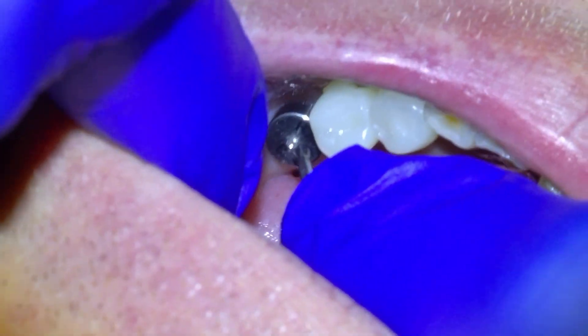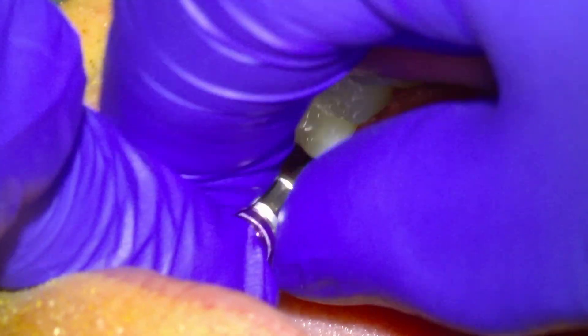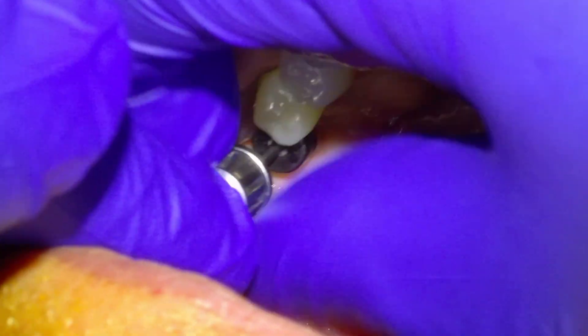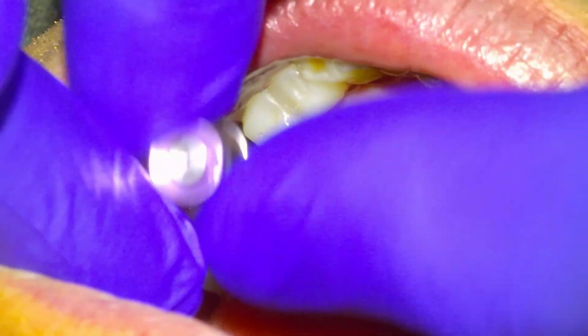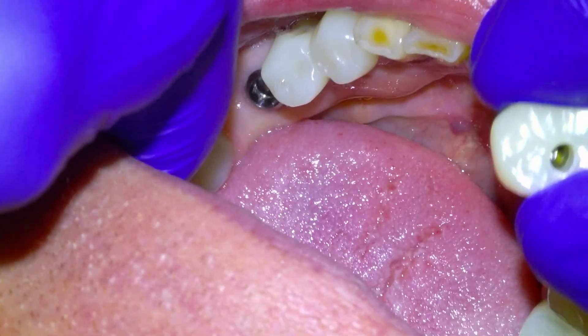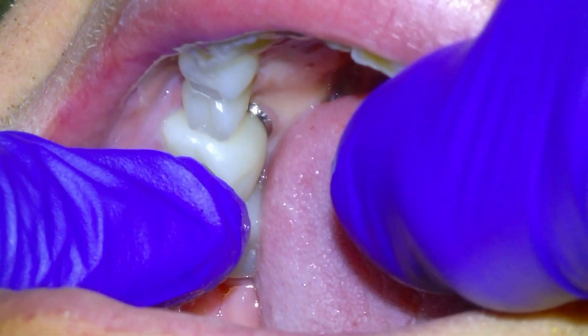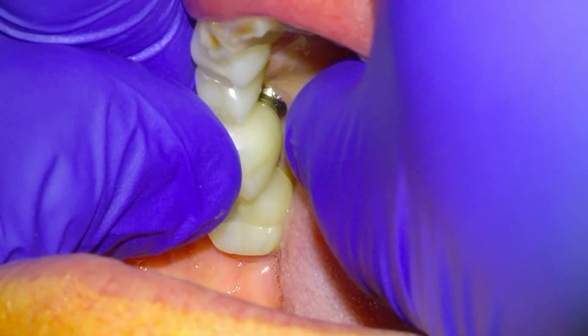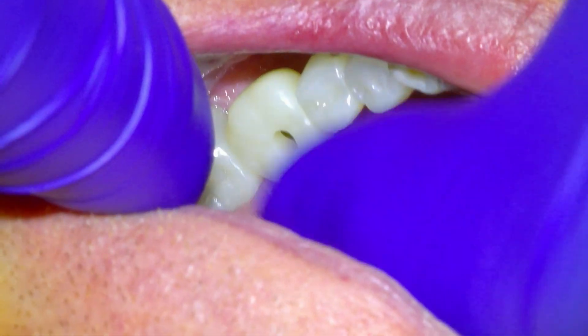We'll take the healing cap off first here. Sometimes it can take a little bit of elbow grease to get it down the first couple of times. When we check the tightness, so it might be a little bit of pressure there. Can that clip down nicely?